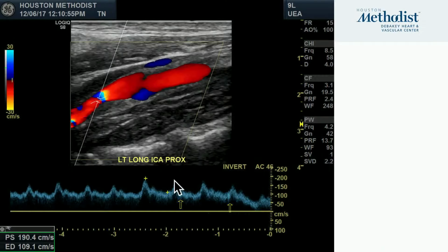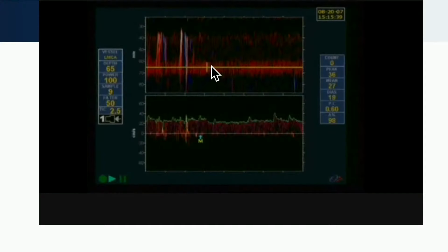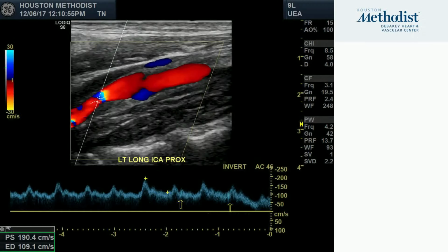This is an example I want to show. Oops, it doesn't play. Oopsie, hold on. It doesn't want to play, but this is again a non-pulsatile LVAD signal, and this is a video that shows you when you have an LVAD turned on, you have the embolus coming. We turn the LVAD off, and you still have a pulsatile waveform. There was no embolus signal. Sorry, this video didn't play.